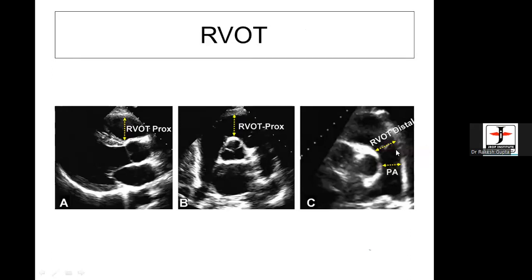Dr. Pranjal, you want to ask something? No, sir. Anybody would like to ask some questions before we switch on to a live demonstration by Echo? Yes, sir. I am Dr. Prakhar Gupta, sir. Prakhar, go ahead.